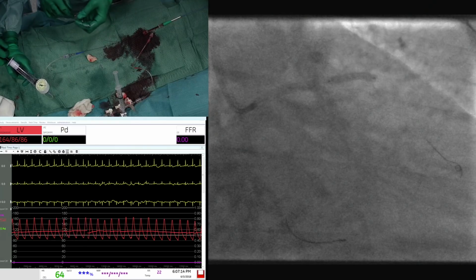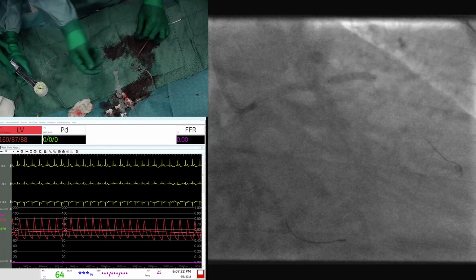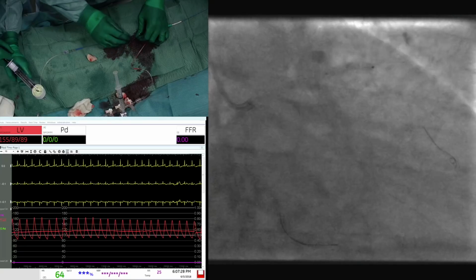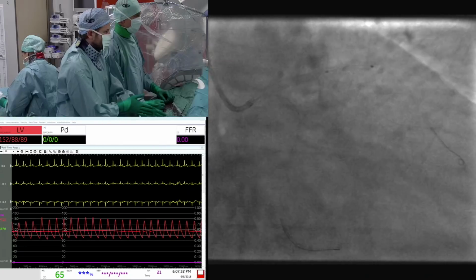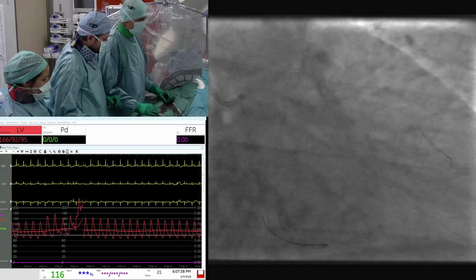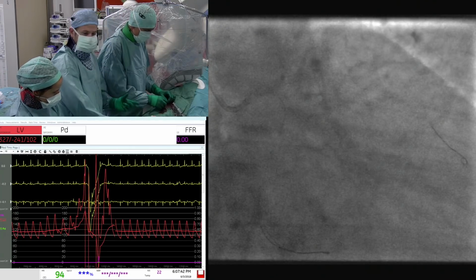Keep it inflated. Yeah, it's okay. I think what will be important at the end is to post-dilate the left main once more, because we have manipulated the guiding around, crossing with the stent, so close the procedure with the left main. Give the 4.5 back. That's true. It's a very good point. Yes, stop. Emmanuel, you are following? Yep, following. Oh, you're right, Gabor.